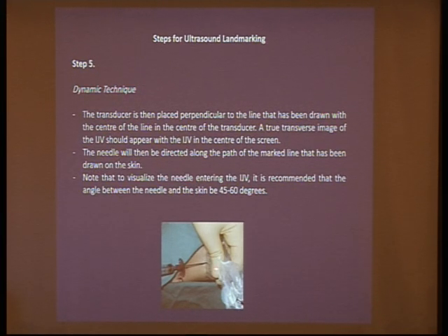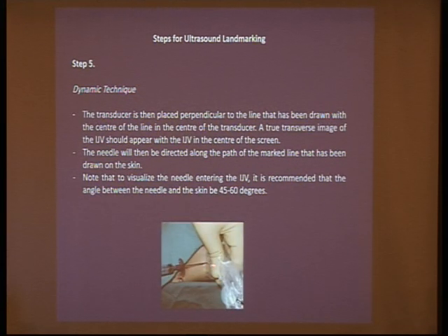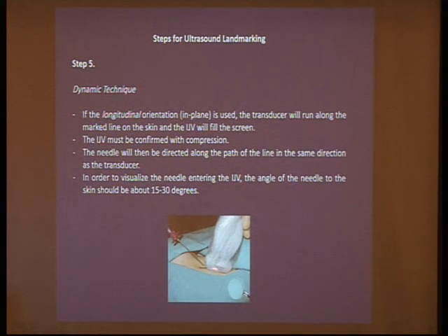In transverse view, you will put the probe in the middle of the line you have just drawn, and you will enter the needle through the line, while in the longitudinal view you will simply follow the line.